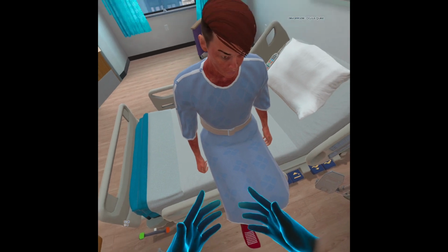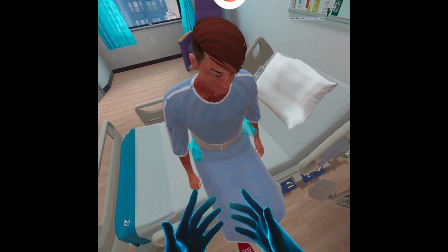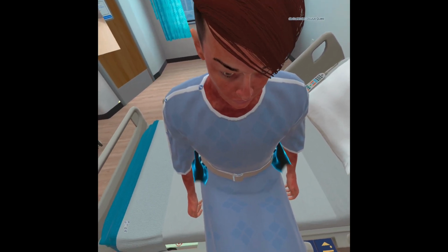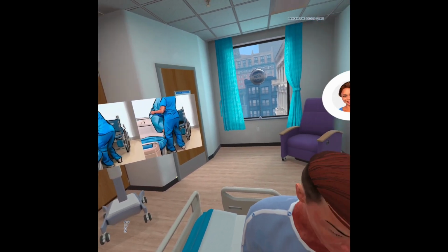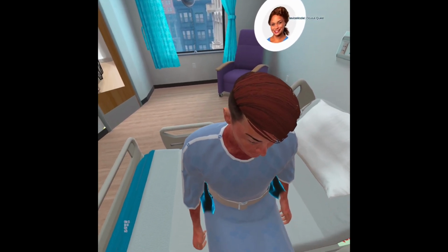You'll use the strength in your legs, not your back, to help Riley up. Grasp both sides of the gait belt. We're going to rock with Riley 3 times. With each count, move with him slightly back and forth, shifting your body weight and his. On 3, use the gait belt to assist Riley to stand.